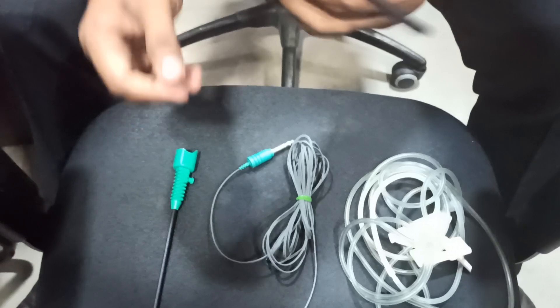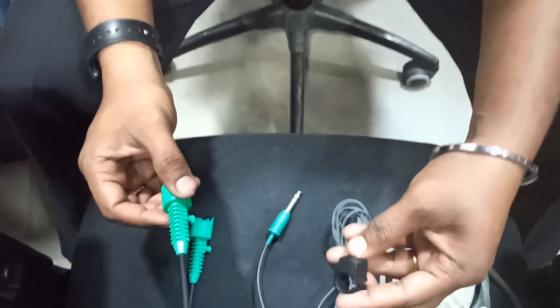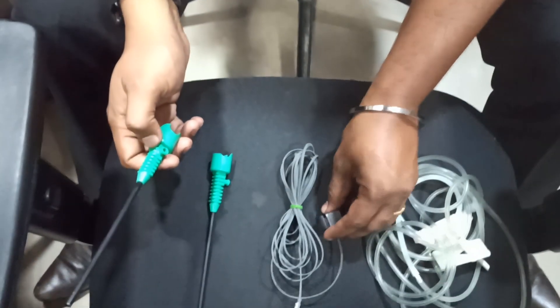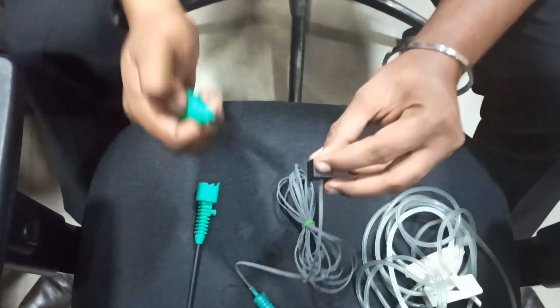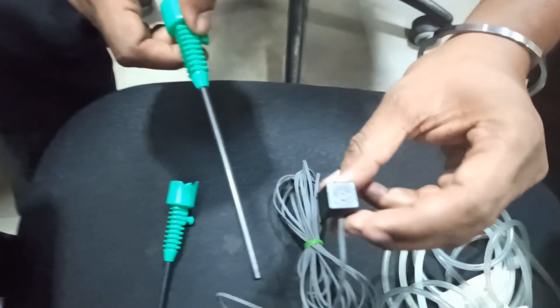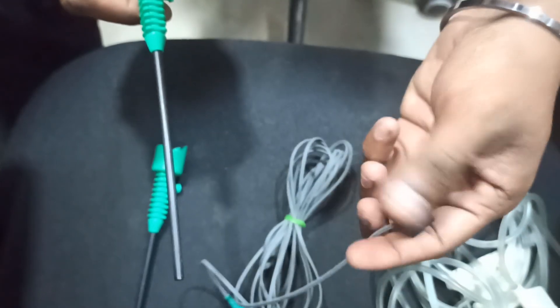Taking the zero degree sheath — the first thing to do is connect the finger switch. We call it the finger switch. Whenever you press the switch, irrigation will automatically come at the tip, so that is the purpose of the finger switch.